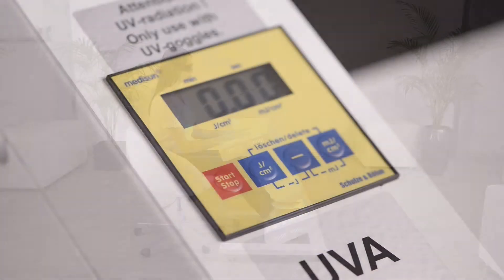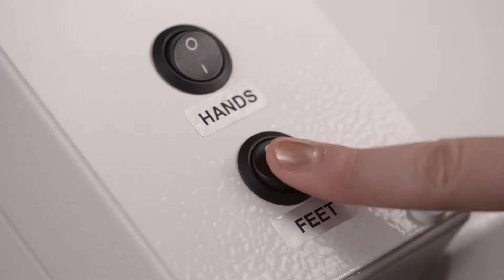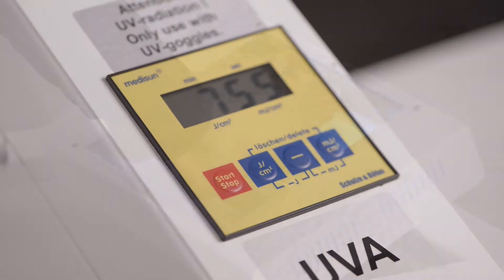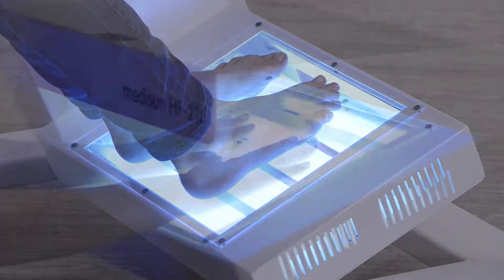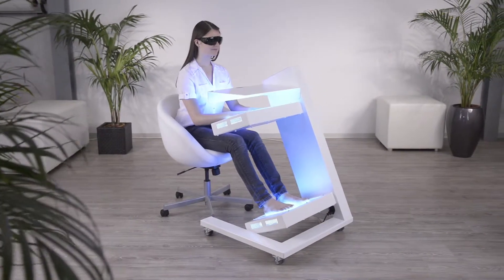The integrated Joule timer allows input in Joule and automatic conversion into the exposure time. Operation and handling are very convenient. Four powerful UV lamps provide for short exposure times.